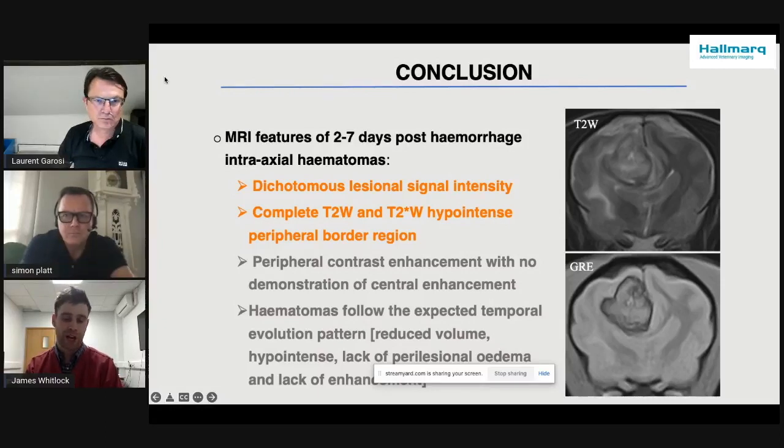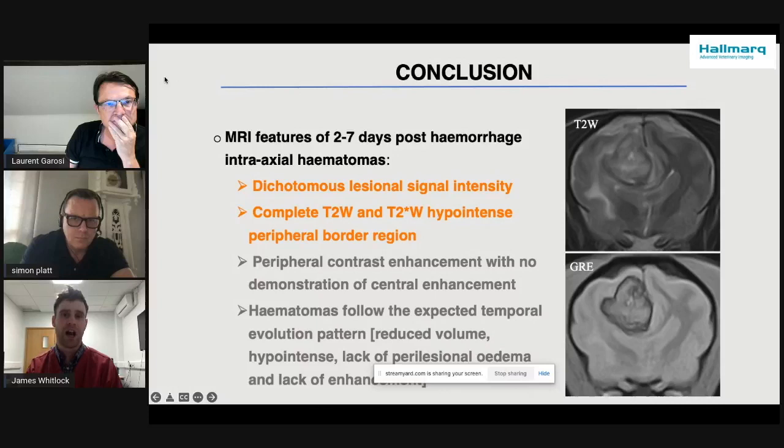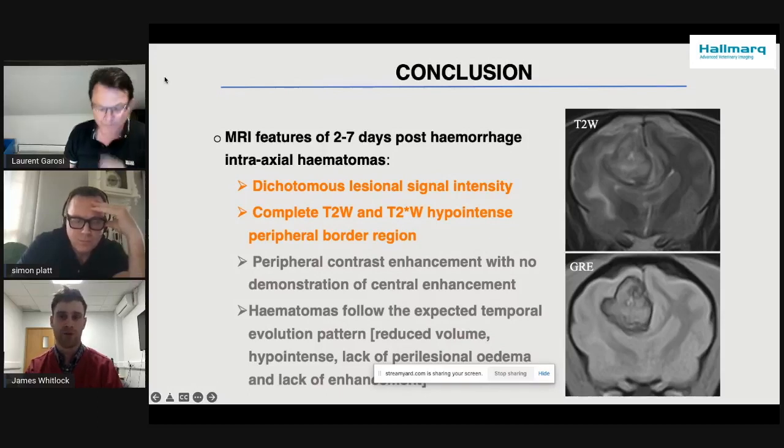And I guess this more ordered appearance to hematomas, it's hypothesized that it's because typically these hematoma lesions are occurring from one hemorrhagic event, whereas you're going to get more variable, irregular regions of different blood breakdown products with neoplasias because of their progressive nature and the constant new hemorrhages appearing within them. So you're not going to get this ordered central and peripheral region.